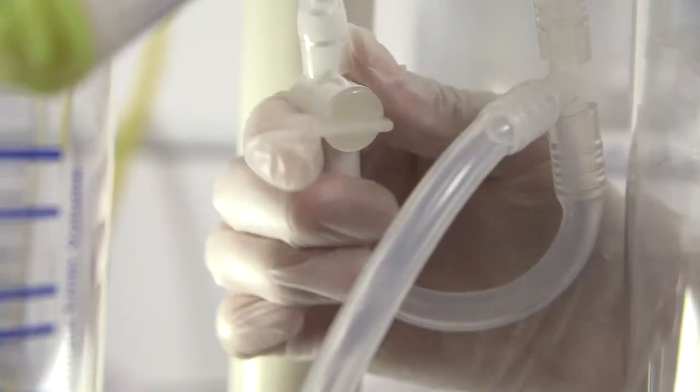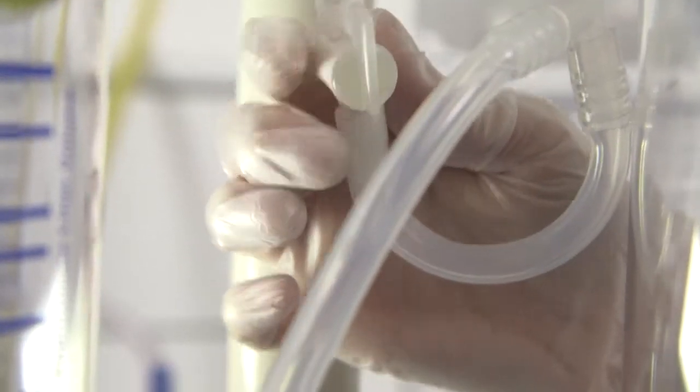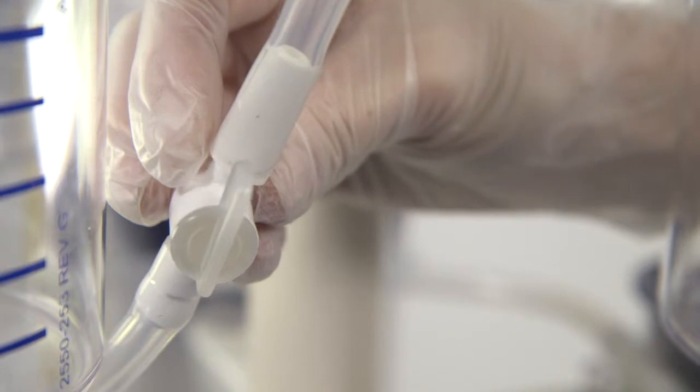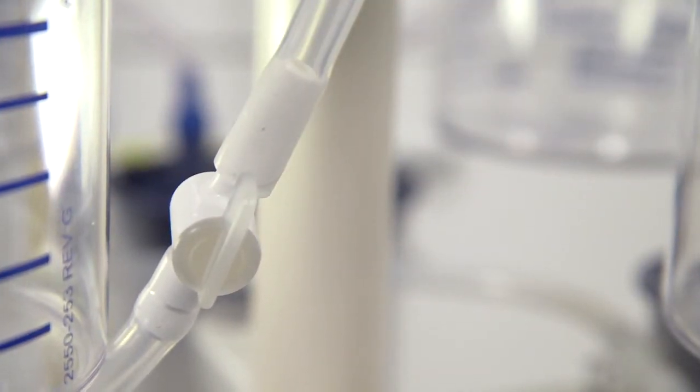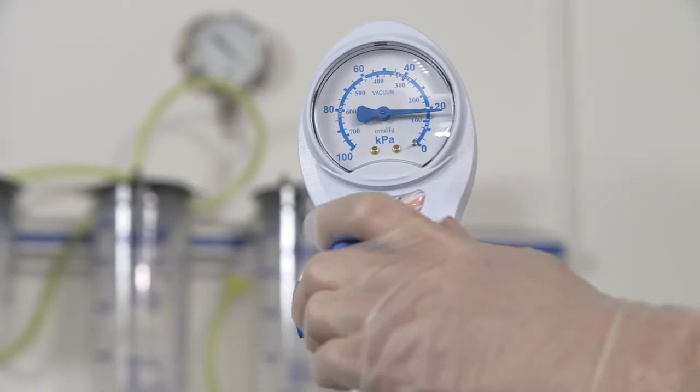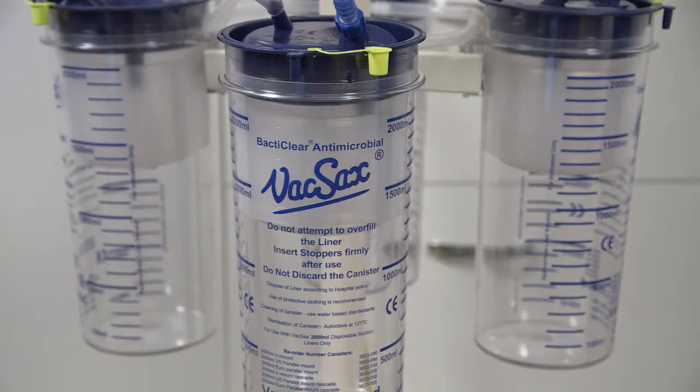Open both siphon taps on the tubing kit. Switch on the vacuum and set to high. Wait until all the liners have expanded into the canisters.